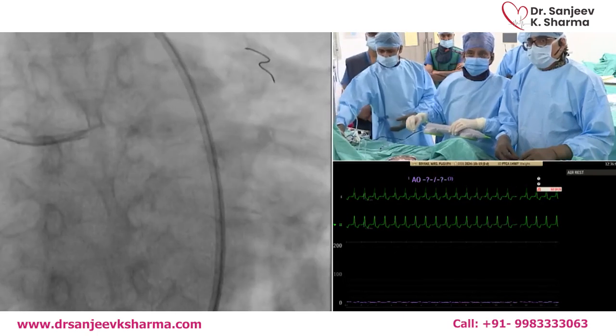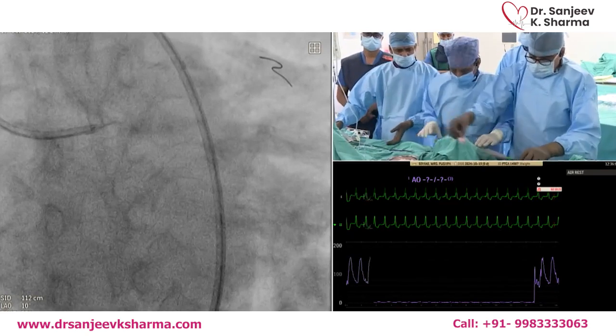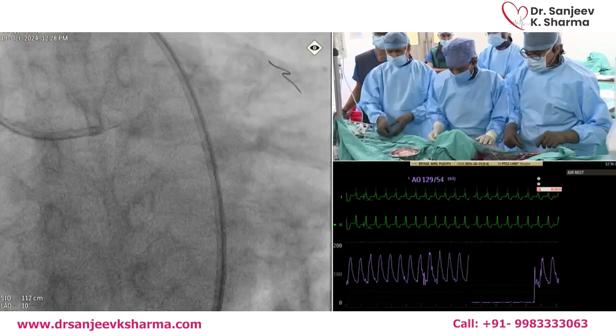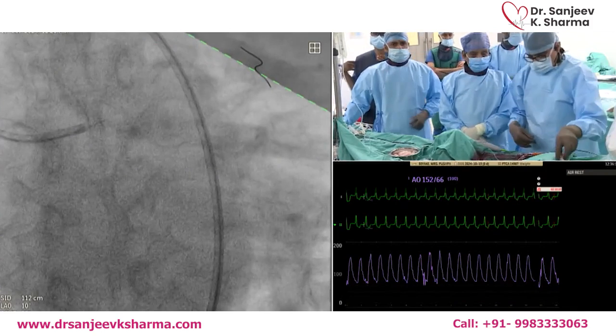Dr. Dangus, you can ask for the opinion of the panelists. All right, let's ask Roxana about IVL versus atherectomy only. Give 1,000 of heparin. Okay, we are ready here. So there is also IVL or not IVL.